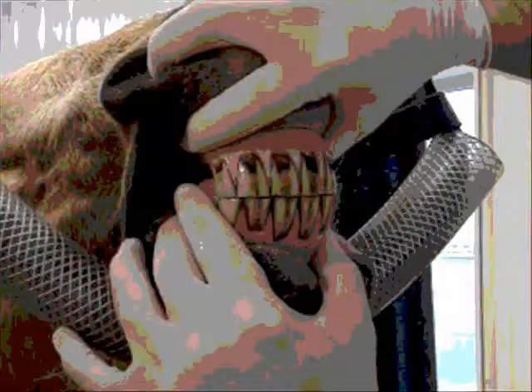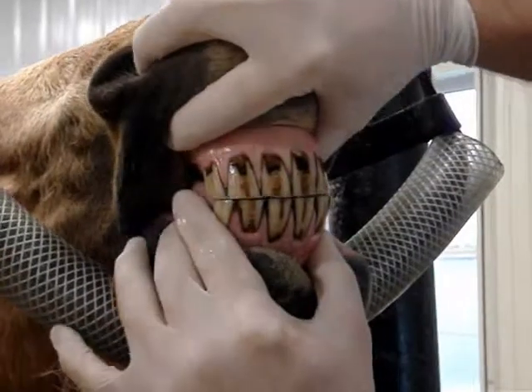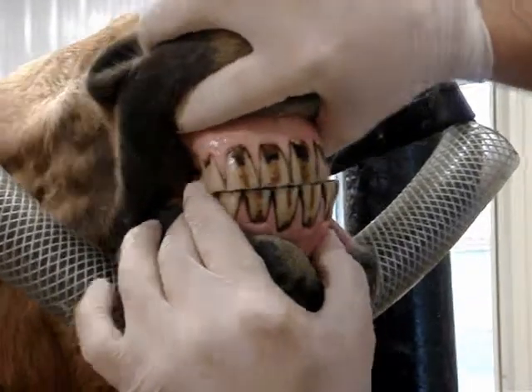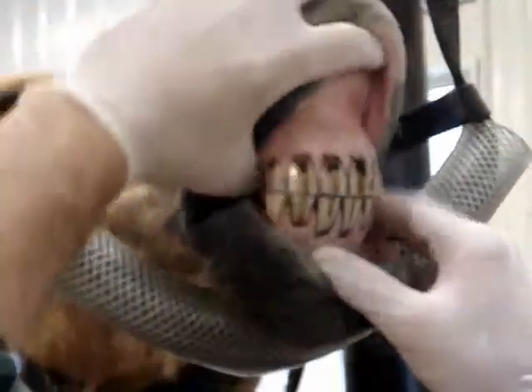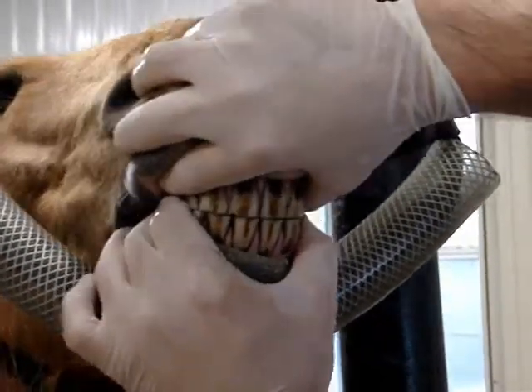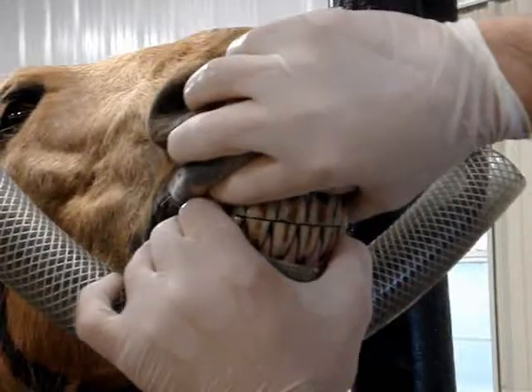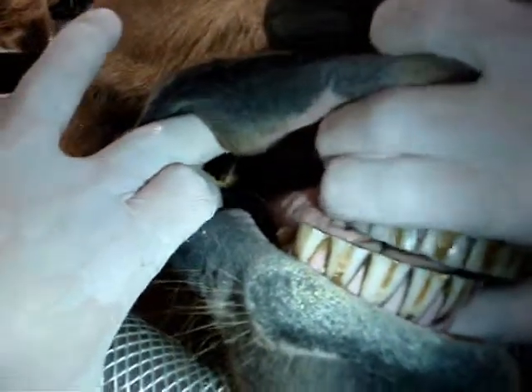The line of the incisors should be straight across. Any slopes or abnormal wearing will be corrected as best as possible. The jaws are then moved side to side to simulate chewing. Their jaws should be free to slide both directions, and as the cheek teeth make contact, the incisors should lift apart. This relationship is evaluated both directions, and any incisors that are too long or that are causing impingement of free movement are reduced.